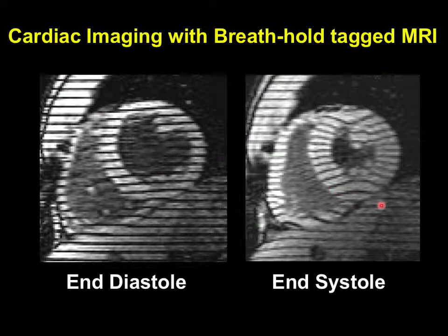Any questions about that? Yep. When you're doing these images across multiple heartbeats, is that just being triggered off the EKG? It's just relying on the patient's EKG being very consistent. That's exactly right. It's relying on the patient's EKG being very consistent.